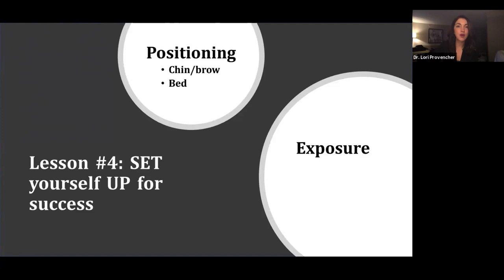And don't forget that bed positioning can be really crucial. If you have a good modified or dynamic bed, you can really use that to your advantage by putting the patient either in reverse Trendelenburg to maybe get over a prominent brow, or Trendelenburg can be nice for patients that are top-heavy and you want to reduce posterior pressure. Exposure is really crucial, and I'll go over a few examples of that.